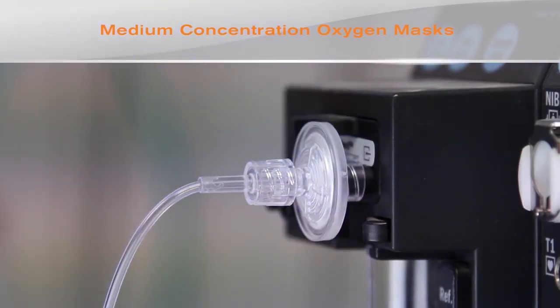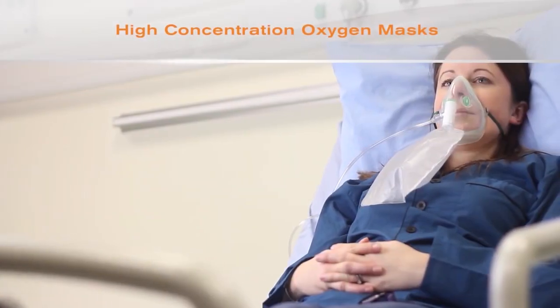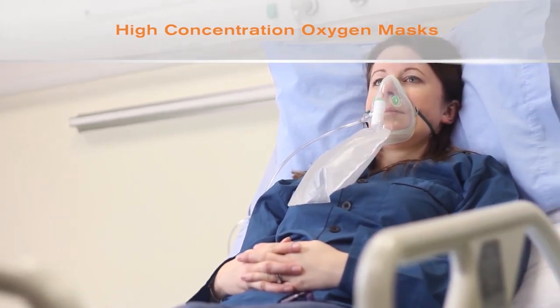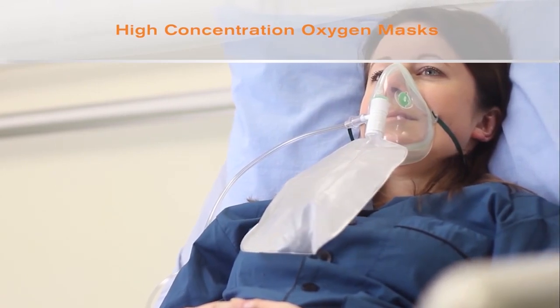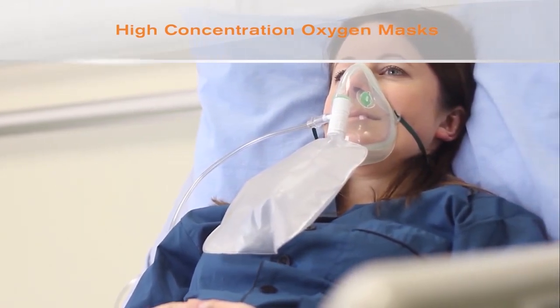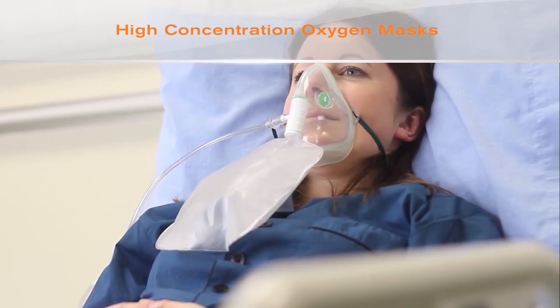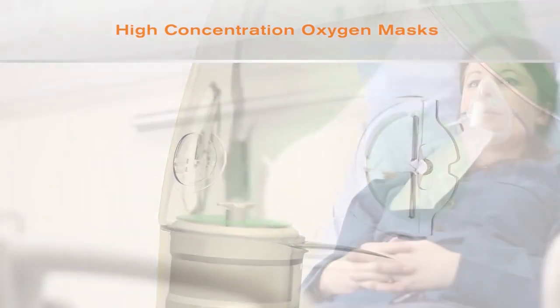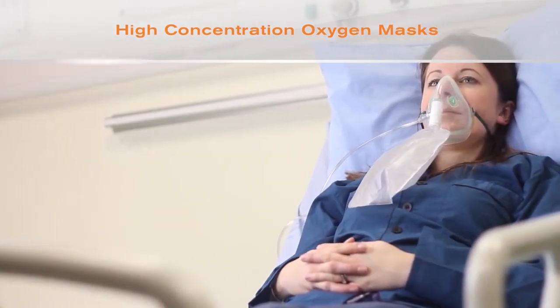The final variable concentration oxygen mask we are looking at is the high concentration mask, also known as the non-rebreathing mask, and is usually used when high concentrations of oxygen are required, for example with a critically ill or unstable patient. The patient breathes from the mask and the inspiratory valve opens so that oxygen is taken from the reservoir bag. The patient breathes out through the expiratory valve. Ideally, the patient does not breathe any room air.